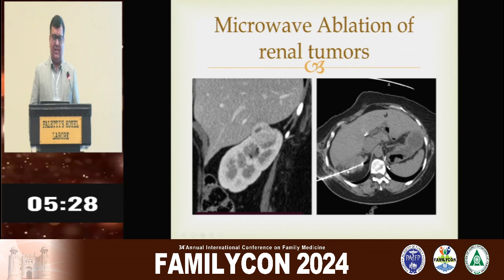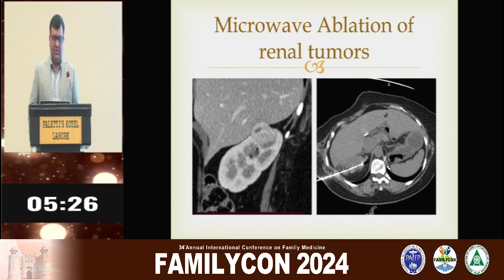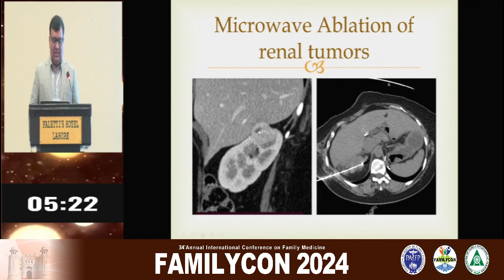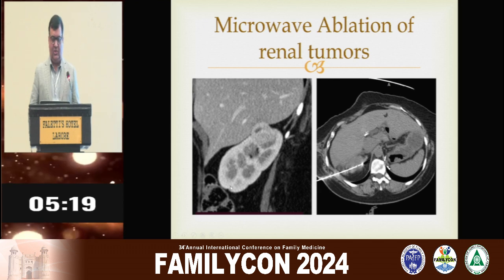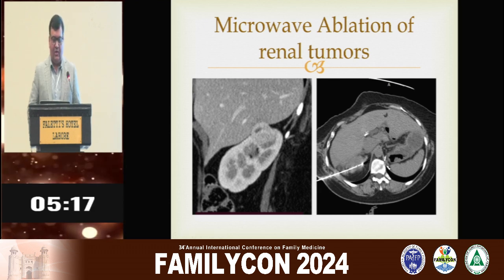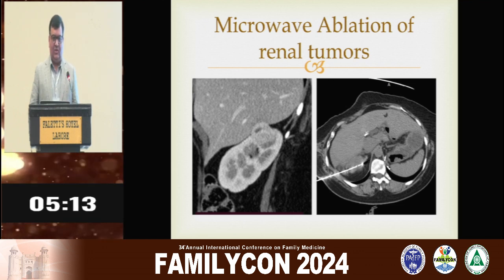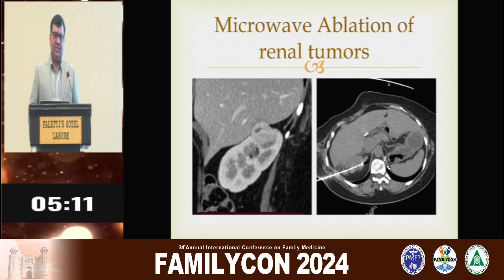This patient had a single kidney and two tumors. One was at this point, and the other was at the bottom, which I haven't shown here. We did RF microwave ablation in this case, and the patient did well, and she is without any renal replacement therapy.